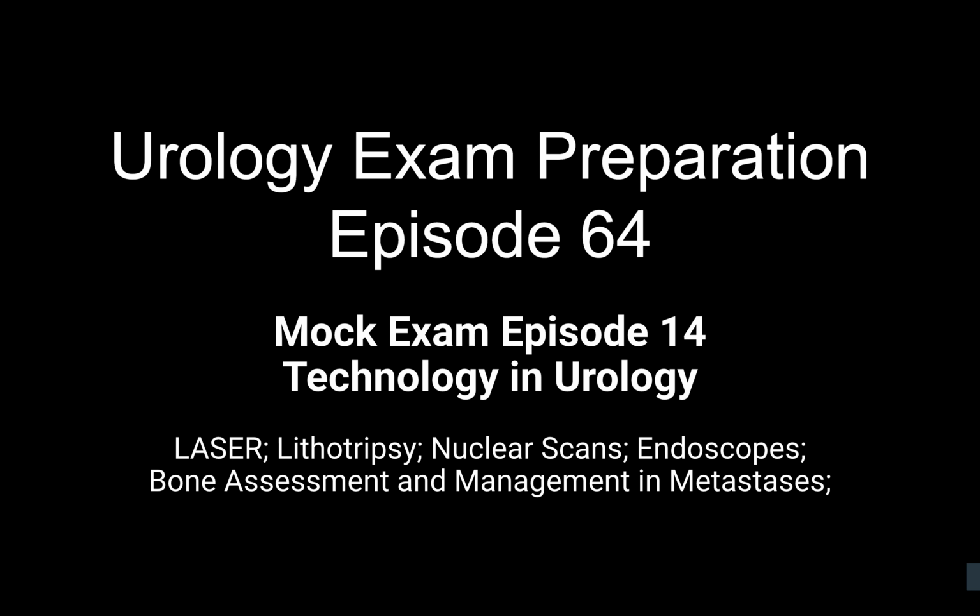So will the settings change for thulium fiber laser? Usually, as the fiber grows smaller, we need to use lower energy, and then we'll have to use higher frequency. And what is the advantage of this higher frequency? With higher frequency, we can achieve dusting of the stone.